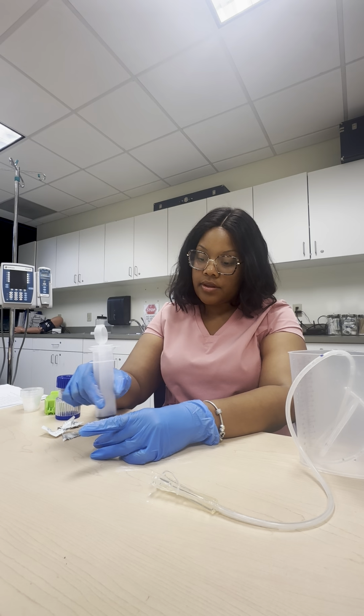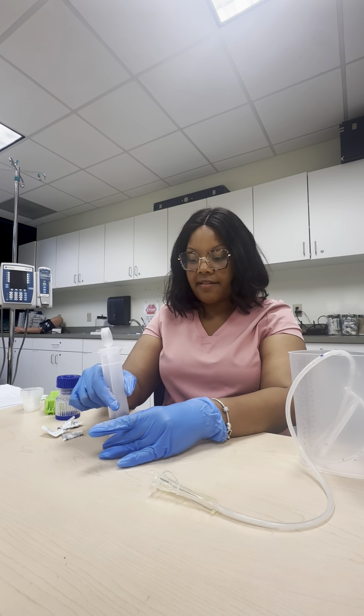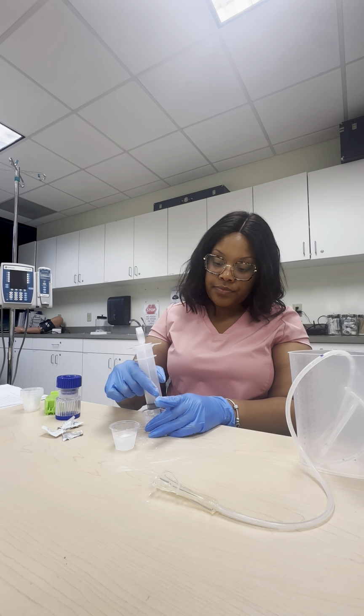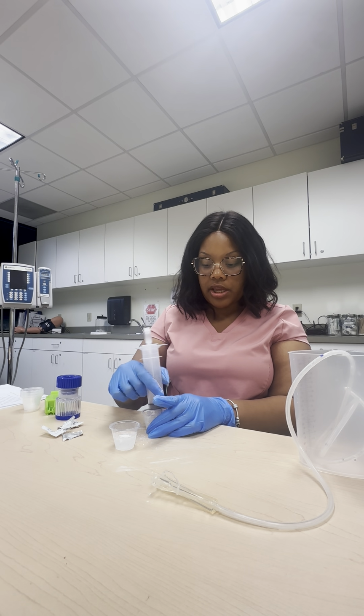All right, so this one is a better example because this one really did a good job of being fine, but this one has some little clumps in it. So these are not real medications, so sometimes they don't dissolve like a real medication would.